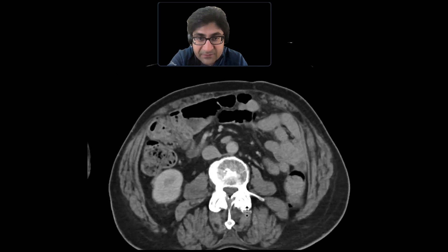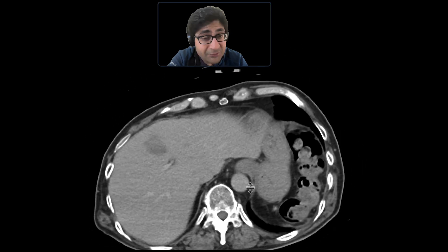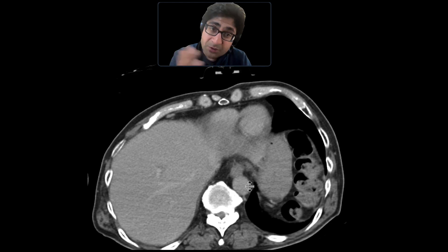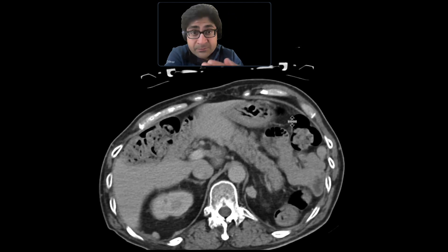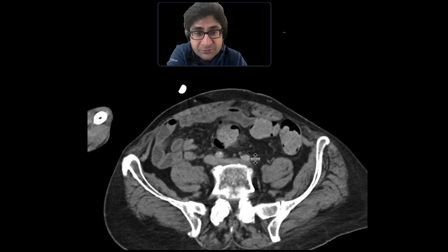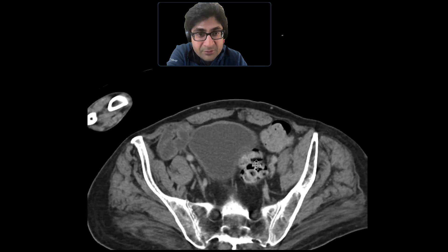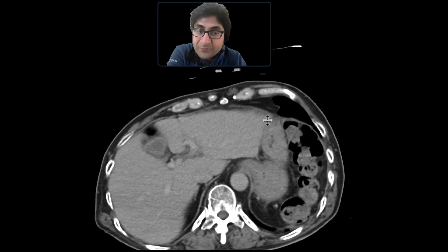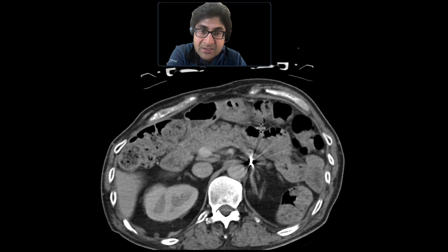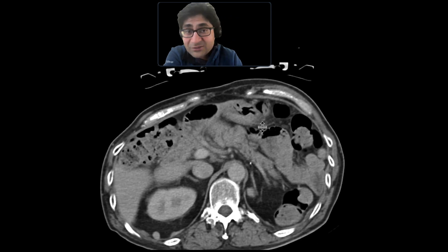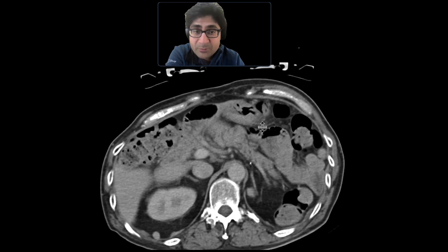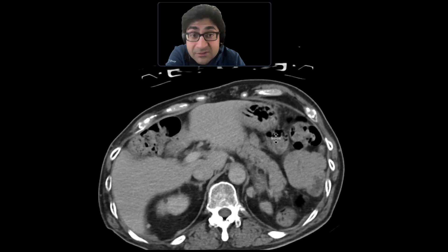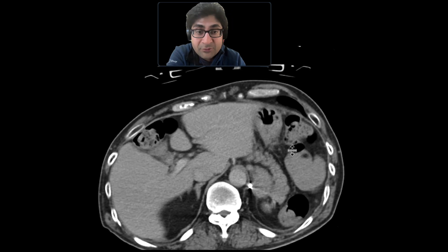What do we make of these? Certainly when we see nodules like this in the context of a neoplasm, carcinomatosis becomes something you worry about. It's possible some of these represent lymph nodes, particularly those down in the pelvis. But we also notice the patient has status post splenectomy. Whenever I see a patient with status post splenectomy and then peritoneal nodules anywhere in the abdomen and pelvis, you start to think about could this be splenosis — ectopic splenic tissue — certainly in the left upper quadrant.